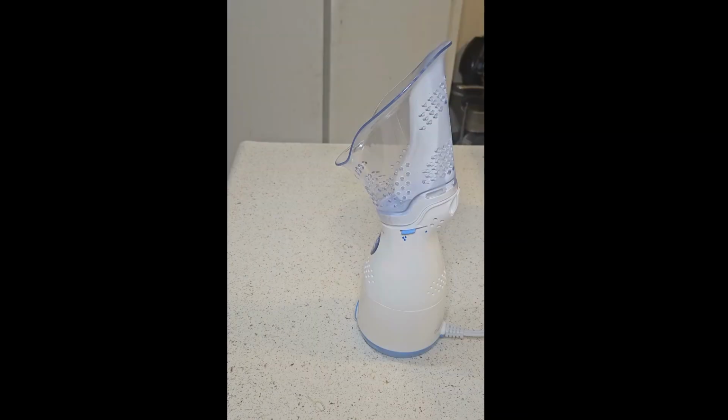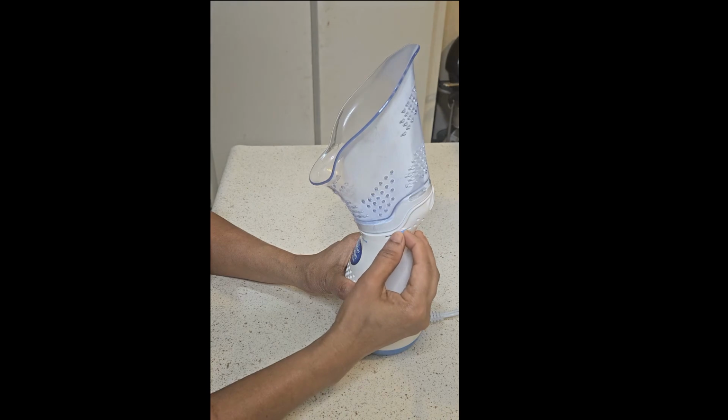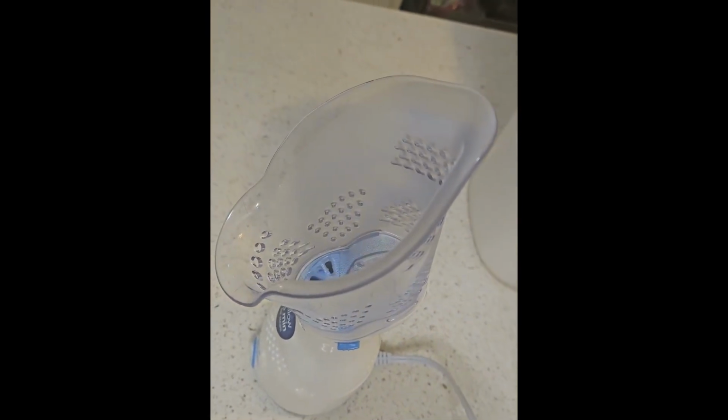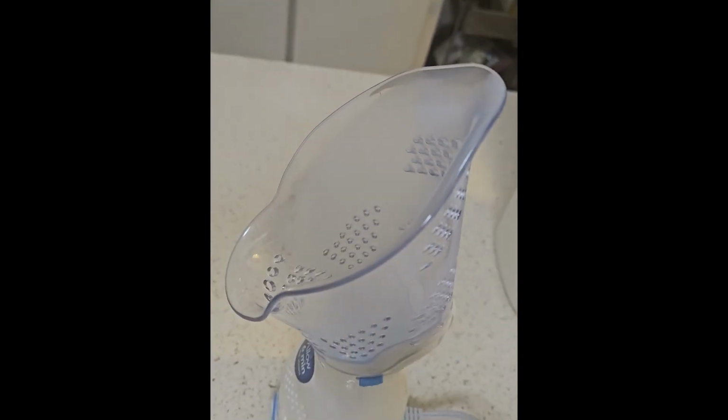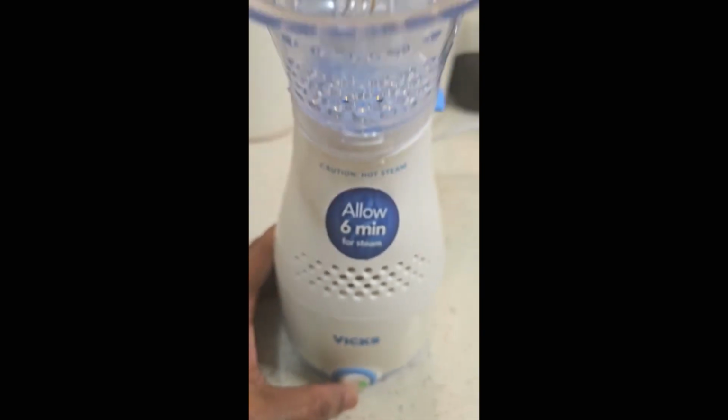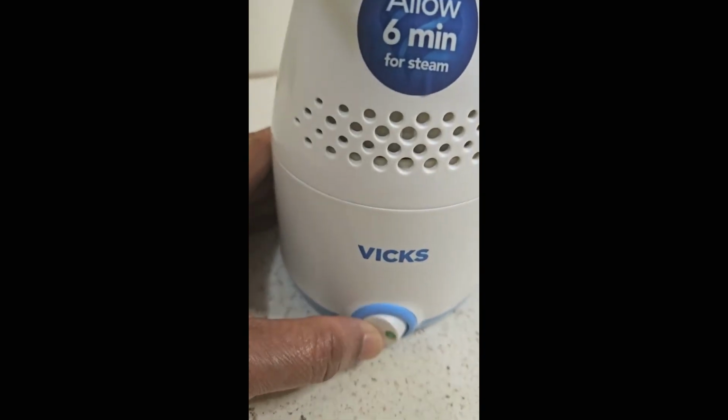It will take approximately 6 minutes to begin making steam. Place your face over the mask. Do not rest your face on the mask. Breathe normally through your nose and mouth, inhaling steam into your nasal and throat passages. Continue treatment for 5 to 15 minutes.